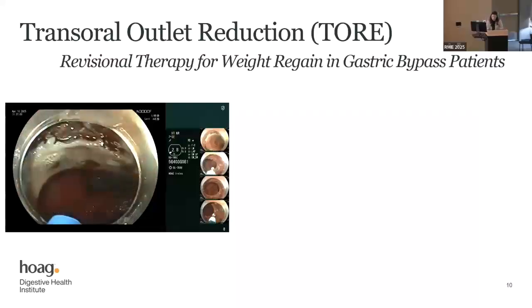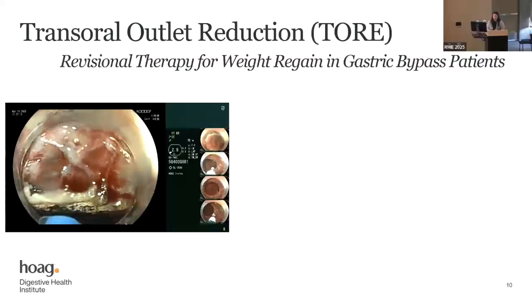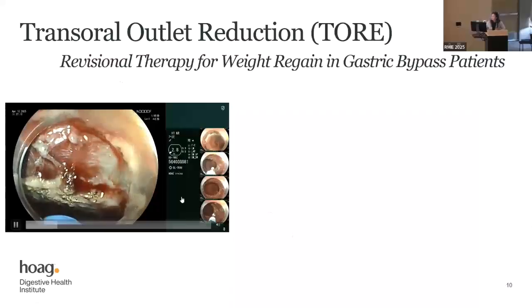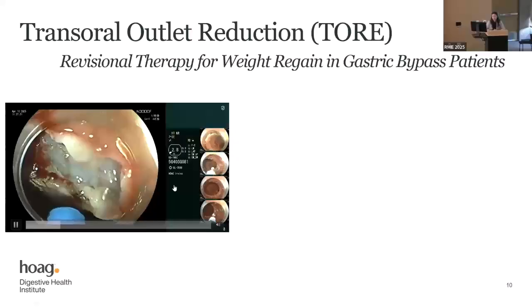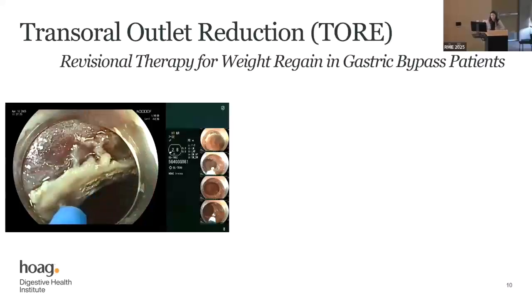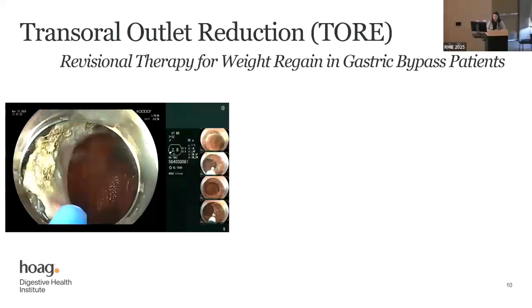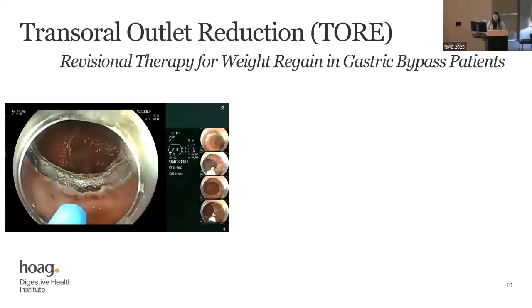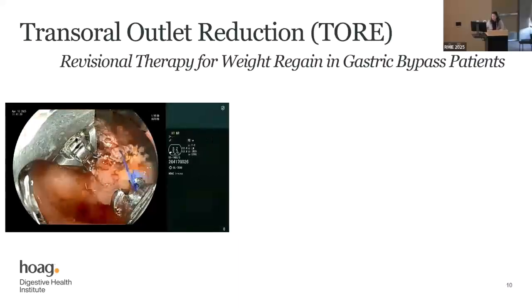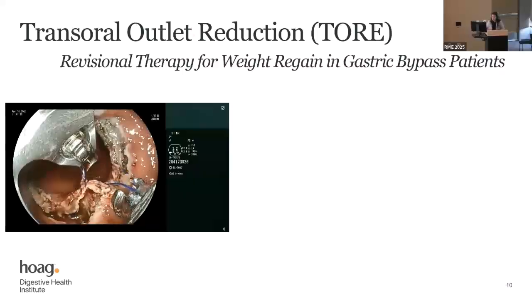But innately, if there's a rim around the GJ stoma, then it's nice to do an almost circumferential ESD. I also leave that runway free, and you'll see that here on this side, that outlet area towards where the efferent jejunal limb is. I leave that open because I want everything to come up towards that space. ESD is done almost circumferentially, and then I use an APC to take away any healthy mucosal tissue that may be in the way. Then using a zipper pattern, first described by Barmaan Budaya, we zipper up and then decrease the outlet down to around 6 millimeters.